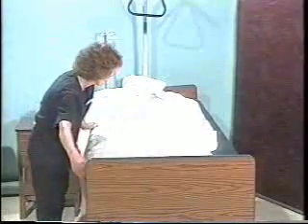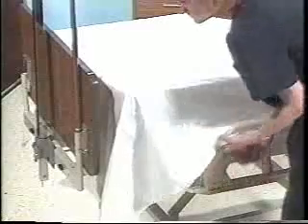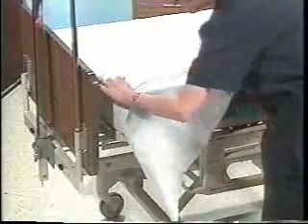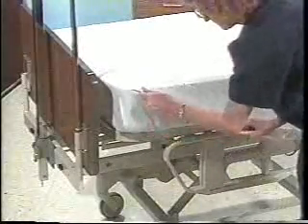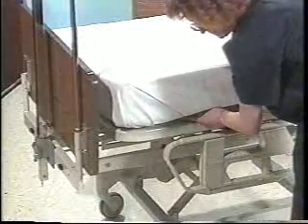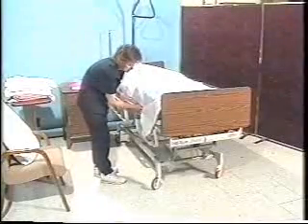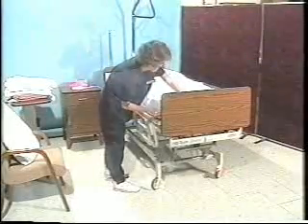Next, the caregiver folds the sheet to the other side of the bed, tucks the top side of the sheet near the hem under the mattress, and makes a mitered corner. To make a mitered corner, the caregiver raises the side of the sheet onto the mattress while tucking the remaining portion under it. Then she lowers the raised part of the sheet and tucks the entire side of the sheet under the mattress. Mitered corners are not necessary if fitted sheets are used. Now the caregiver continues to tuck in the sheet, moving down the length of the mattress.